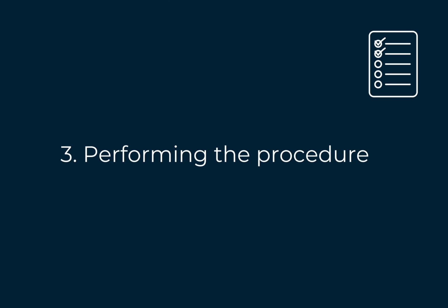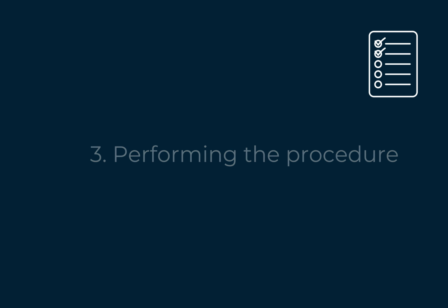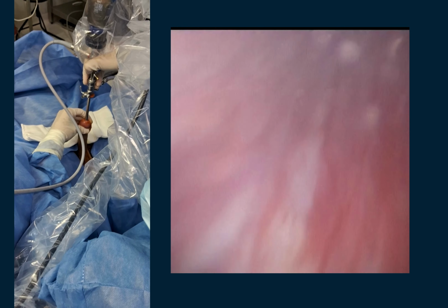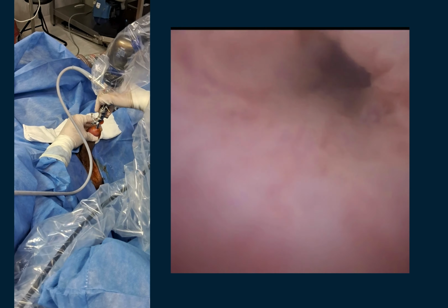To begin the procedure, gently advance the cystoscope through the urethra into the bladder. Apply gentle pressure to ensure smooth navigation, while avoiding any excessive force. The cystoscope is carefully maneuvered until it reaches the bladder, where it is positioned for optimal visualization.